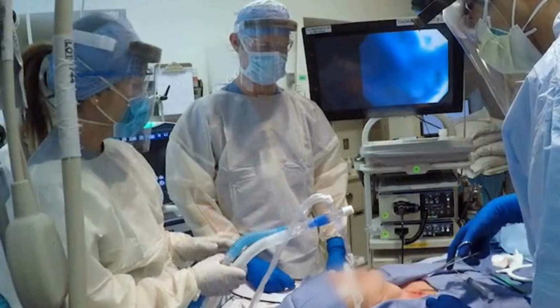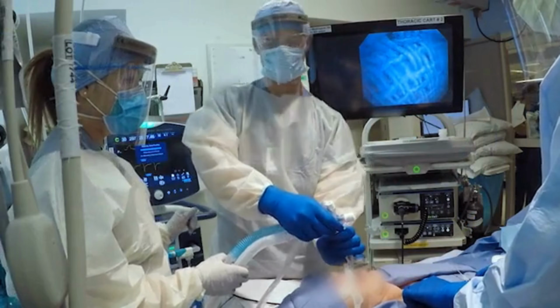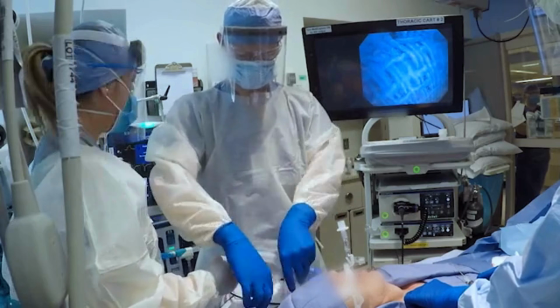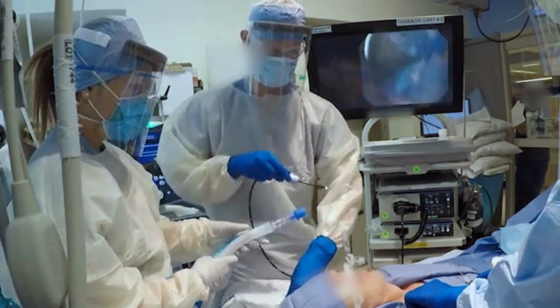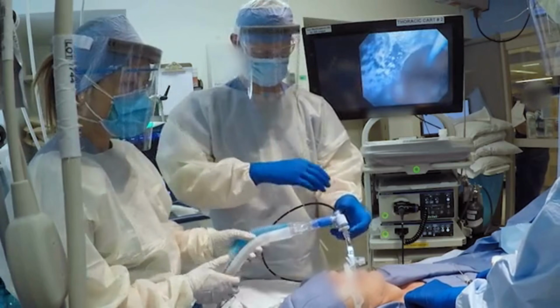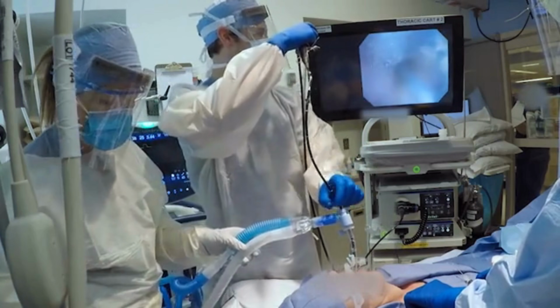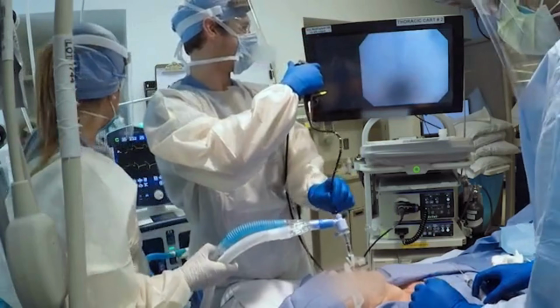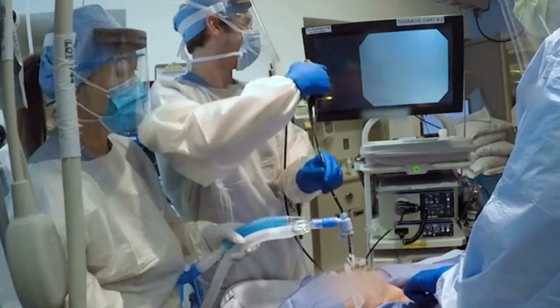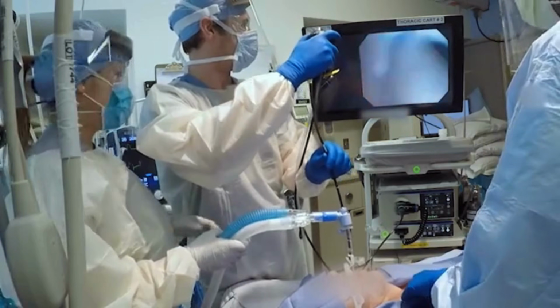Next, ask the respiratory therapist to induce apnea by placing the ventilator on standby. Then, disconnect the oral endotracheal tube from the ventilator circuit and attach a bronchoscope adapter. Insert the bronchoscope into the adapter, reconnect the circuit, and resume ventilation. Advance the bronchoscope into the airway. Briefly survey the trachea and clear any obstructing secretions. Once everyone's ready, advance the bronchoscope into the oral endotracheal tube until the camera aligns with the tube's end.